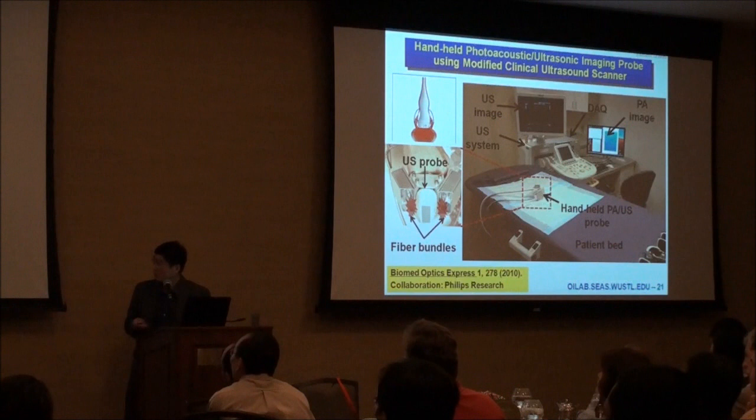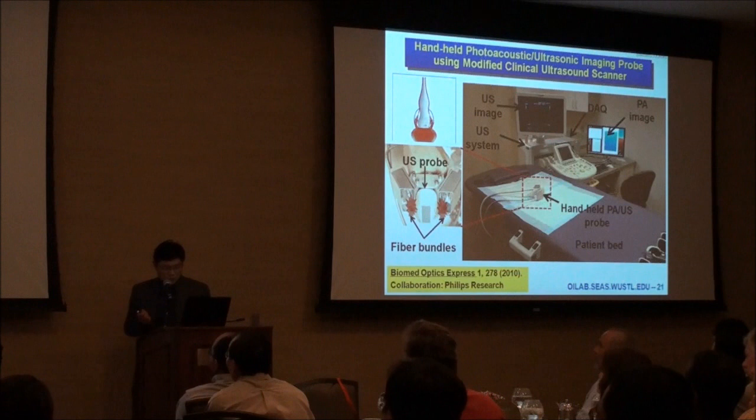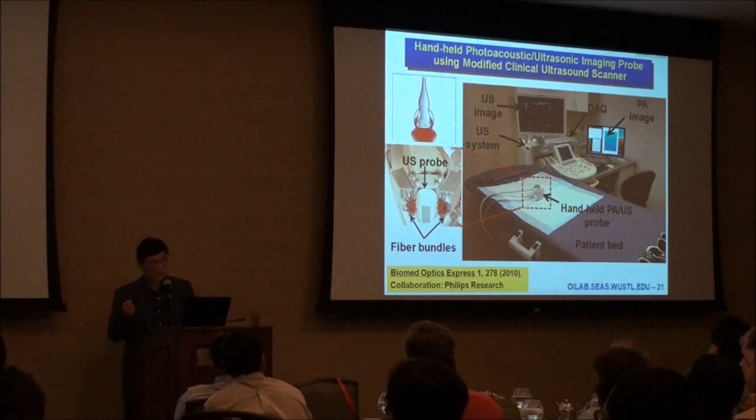Fundamentally speaking, this is a very fast technology in terms of data acquisition. And we're targeting a number of applications using this system. One of the key ideas is to piggyback photoacoustic tomography on conventional ultrasound technology, which is very widely used in clinic, so making sure physicians feel comfortable adopting our new technology. If you give them a new technology, they may hesitate. If you tell them this is an add-on to ultrasound imaging, they already feel comfortable using ultrasound, and they may be more receptive.